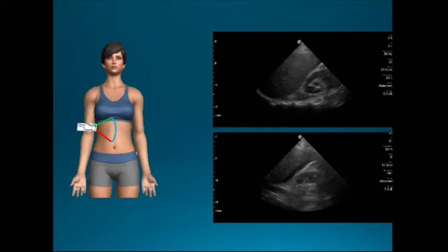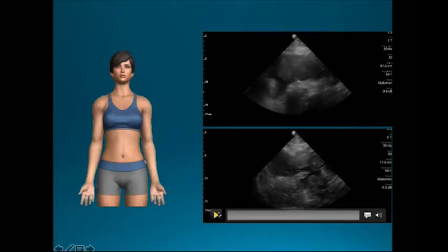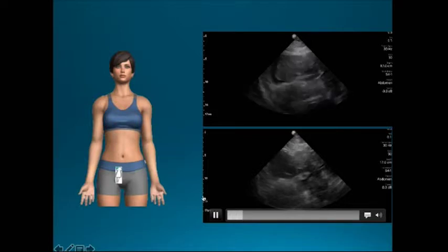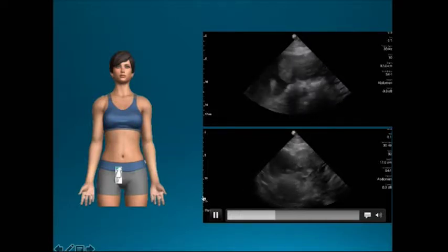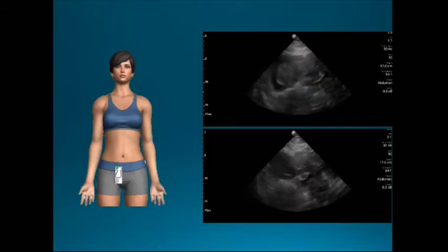Not good. Go down, look at her pelvis. She's got fluid in her pelvis. She's got a big old mass right here. And what I'm doing is gently just kind of pressing with the probe. You can see the fluid kind of swirling around. You can see this mass kind of floating in all this fluid. I was like, we got a problem.